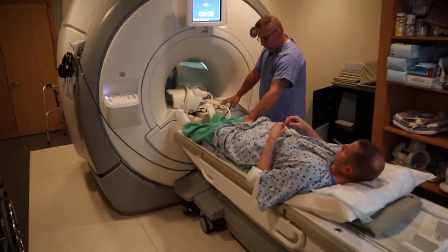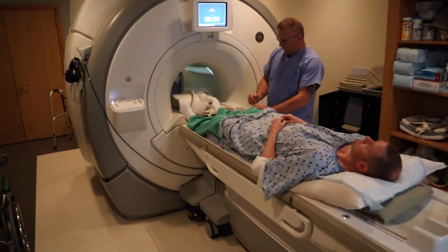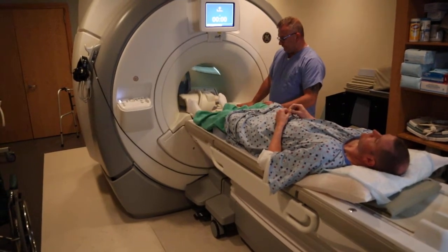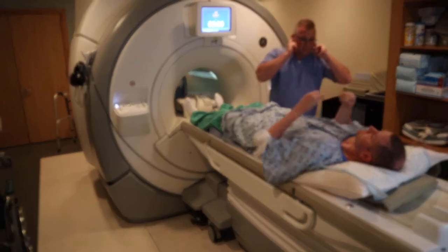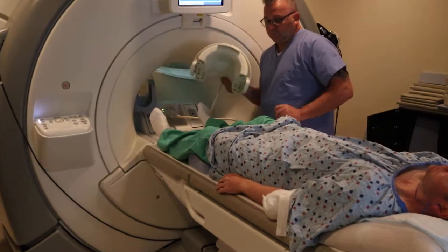The positioning landmark for the knee is going to be the apex of the patella. The patient is going to put earplugs in.